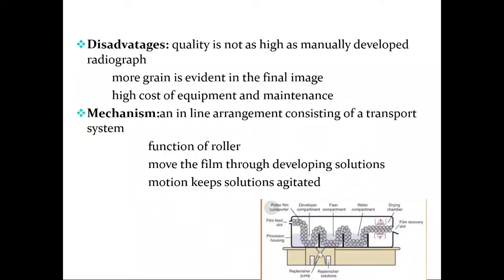So the emulsions rapidly fill again with solution, thus promoting the solution exchange itself. Finally, the top rollers at the crossover point between the developer and the fixer remove the developing solution itself, minimizing the carryover of the developer into the fixer tank. So that is why we avoid the water rinse part in this, when compared to the manual method.